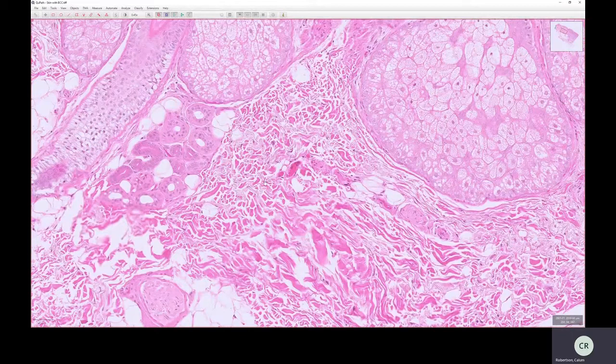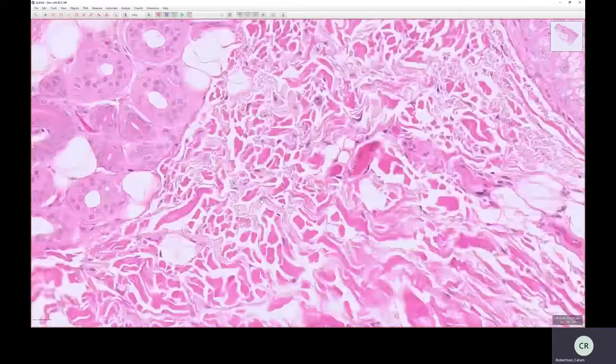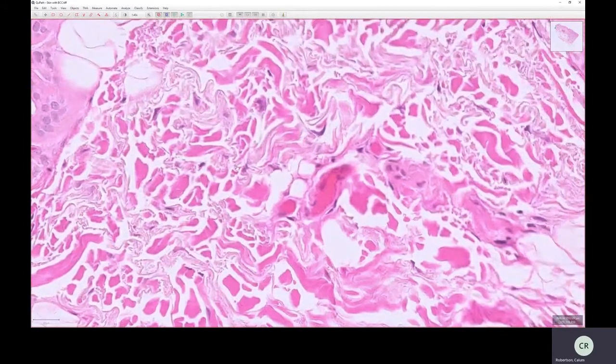But I mentioned that the collagen will be maintained by cells, and the cells that maintain this collagen are these cells. We've got little nuclei here and here and here, little elongated cells that taper from one end. It's fat in the middle, and it tapers to this end and tapers down to that end. We call that a spindle shape or a fusiform shape.